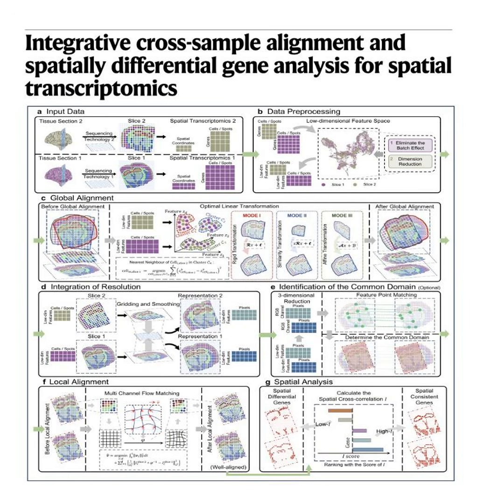To understand how CODA finds these hidden disease markers, we first have to look at its engine. How does it act as a master cartographer to perfectly align those distorted maps? Right. It does this by moving from the macro level down to the micro level. So getting the map right side up. If I hand CODA two incredibly messy, distorted slices of tissue, what does it actually do first?